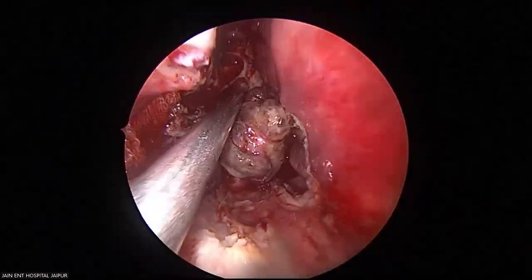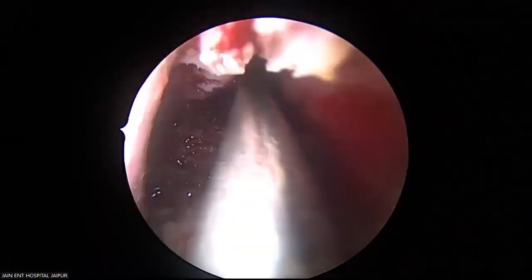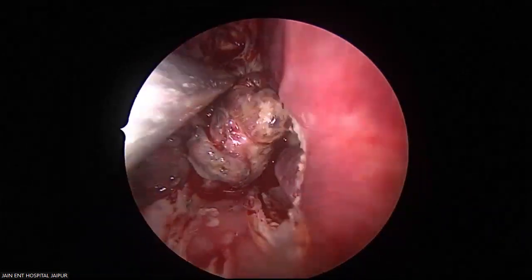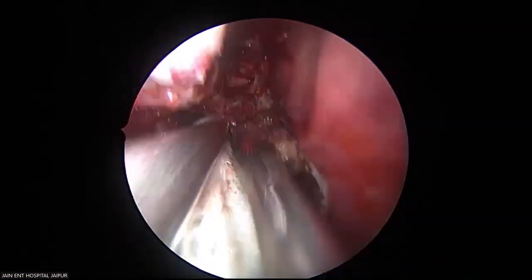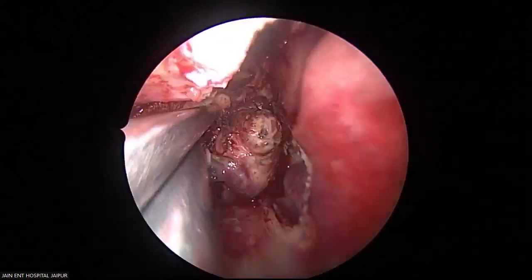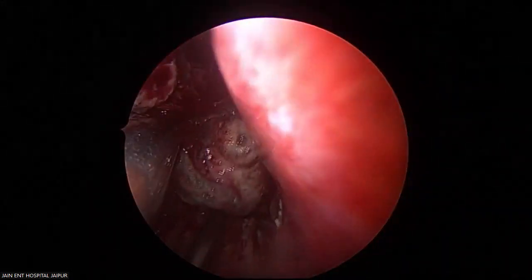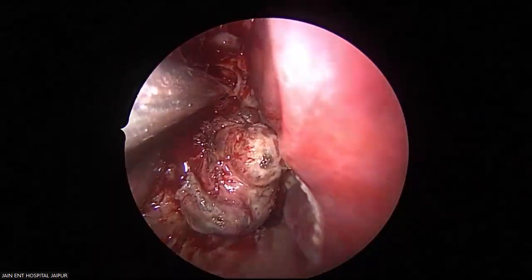Now I will use the coagulator and divide this medial lateral junction. In a minute's time, this is planned division, so that we can mobilize the entire lateral component. Since it has a major lateral extension, we had to resort to this planned division.